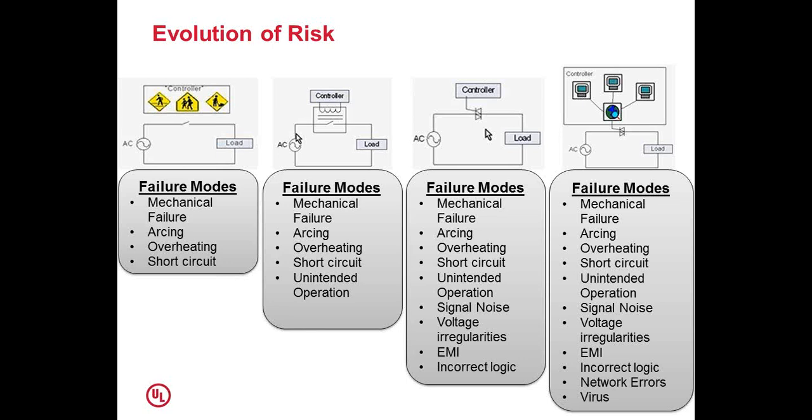The same load, same AC, but the control is through a triac, by which we have increased the complexity but we have kept the patient and the user very safe from electric shock. At this point, we can see that there could be a mechanical failure, arcing, overheating, short circuit, and unintended operation as in the previous one. In addition, we could also see signal noise, which could trigger the triac, voltage irregularities, EMI, and incorrect logic.